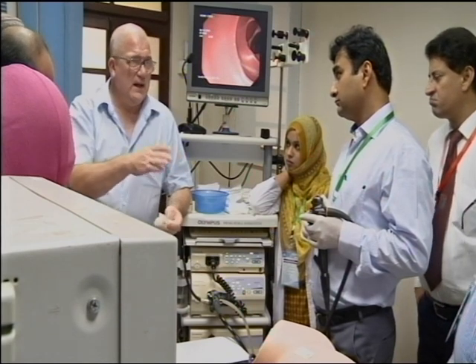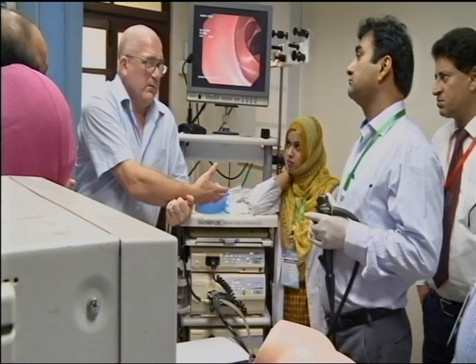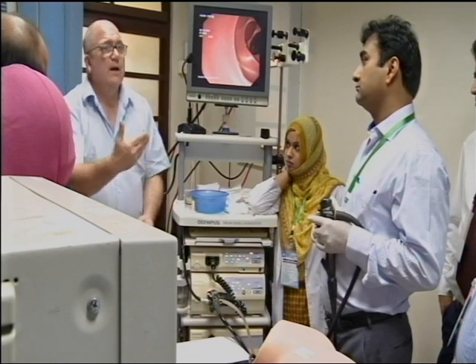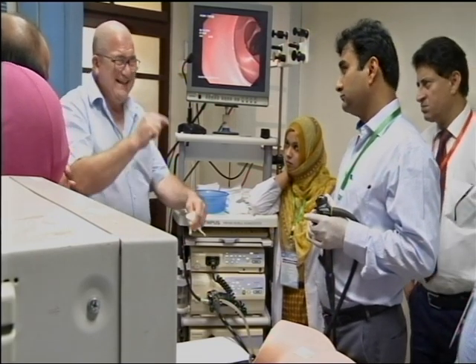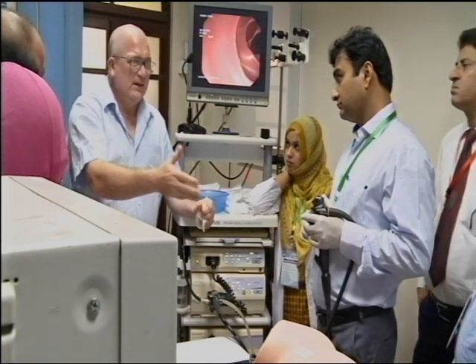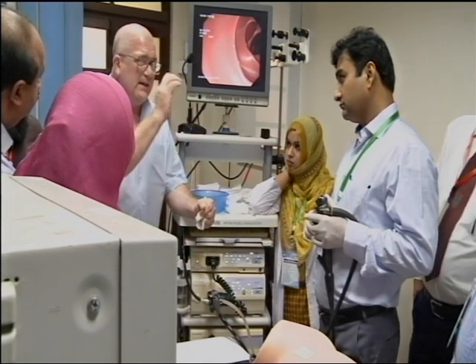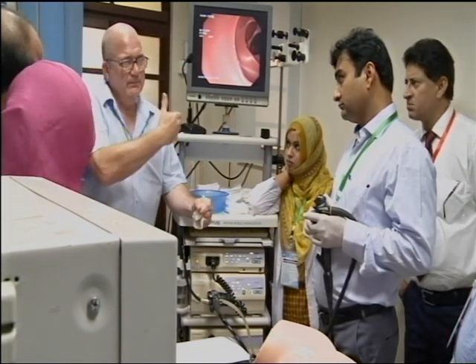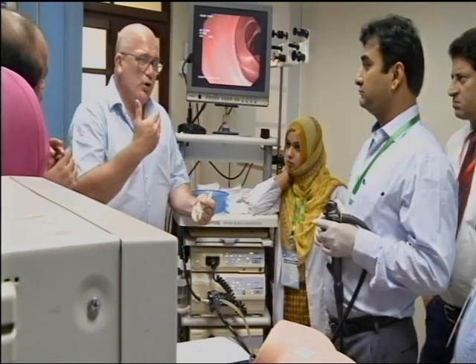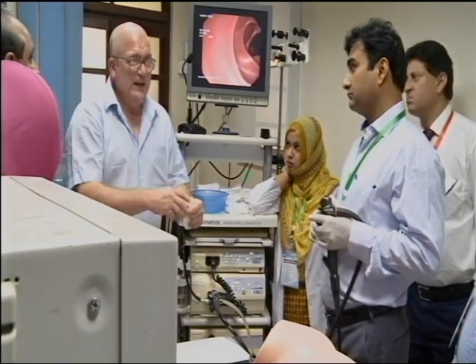There are occasions, when I was here last time, I got my friend here to do the PR on a couple of ladies and pass the scope in. I know who I can and can't. There are times I need to see the anus because of what's going on and what the case presentation is. But if there's a history that I know means I don't need to see the anus, I don't mind, for confidentiality. I prefer that, but no surprise attacks. Surprise attacks get a demerit, get a kick in the shin.